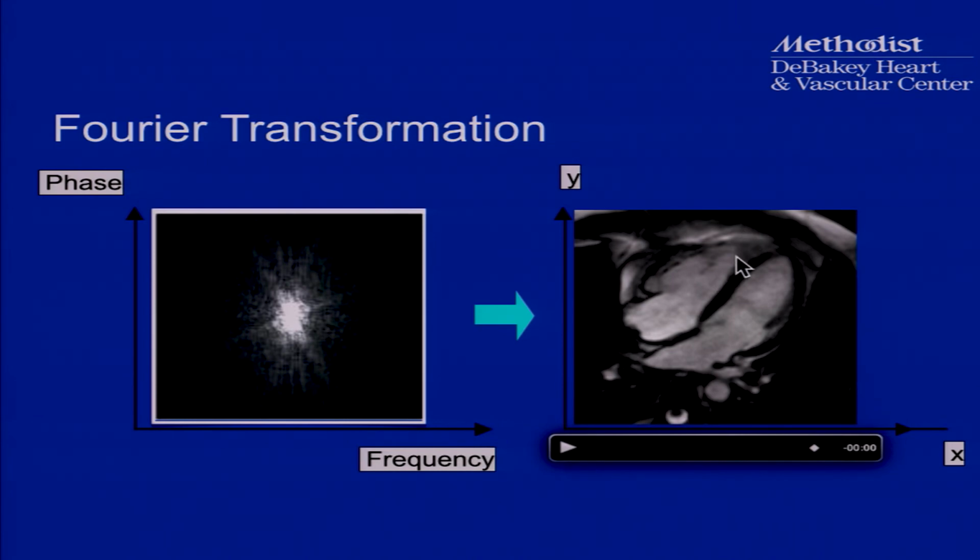All right? So I think the one basic principle to keep in mind is that with MR, each line of data that we acquire somehow contributes to the image. So I could reconstruct the image with only the top half of K-space, and it would not give me just the top half of the image. It'll still give me an image. It's just that the image properties may be altered somewhat, so the resolution, the signal to noise, or the image contrast may not be the same. But the basic principle is that every single line of data that you acquire doesn't just acquire part of the image, but somehow contributes to some aspect of the image. You can generate an image with just the center of K-space, with just the peripheral lines of K-space, with just the top half, the bottom half, whatever you want.